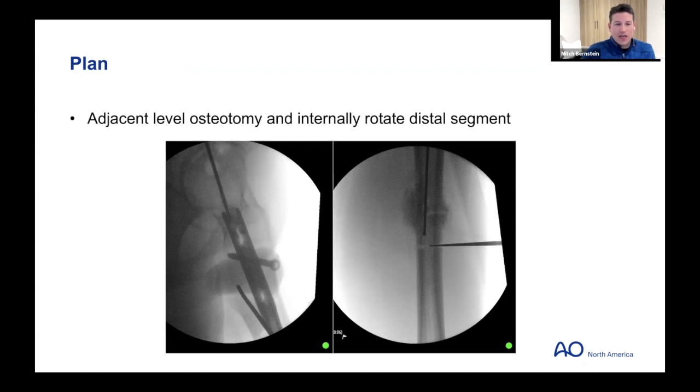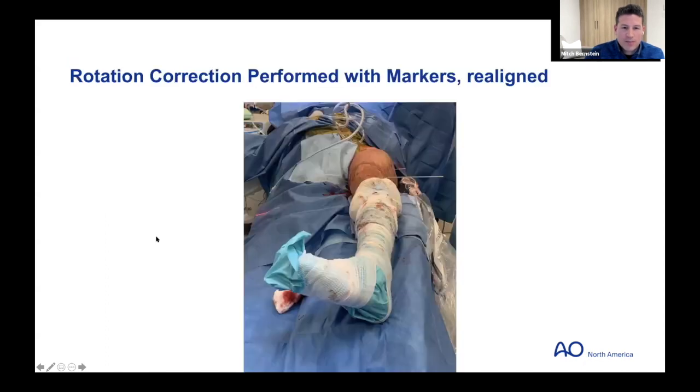I used smaller Schanz pins, one in the lesser trochanter corridor behind the nail, and one in the distal femur around the nail. And I use a sterile goniometer typically, but occasionally I'll use that Carpenter app. I agree with you, Brett. I make them collinear at the end. So this is him with his wires collinear after. And he was quite happy.